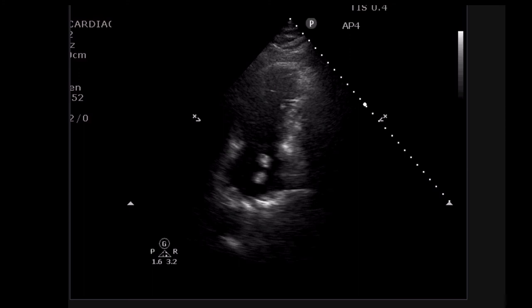Sometimes it's obvious. This is a good example where the RV gets big and pushes the LV out of the way, but the RA isn't actually that dilated at this point. The RV is dilated because of the acute clot in the pulmonary tree — an acute PE presentation.